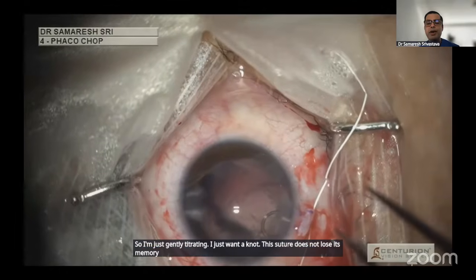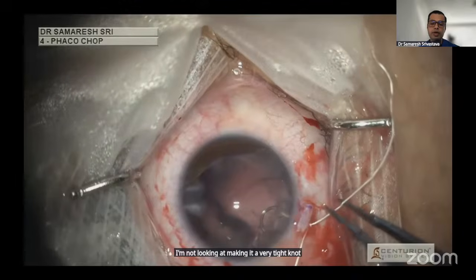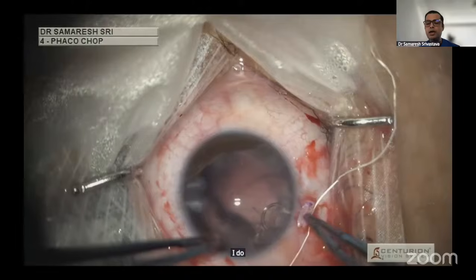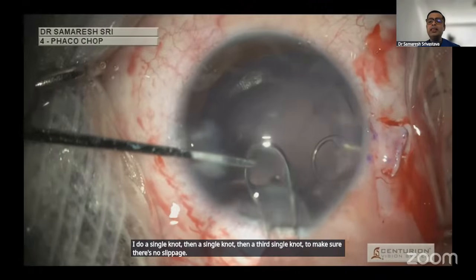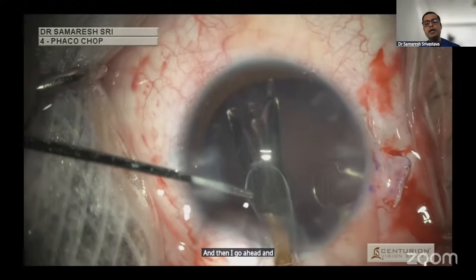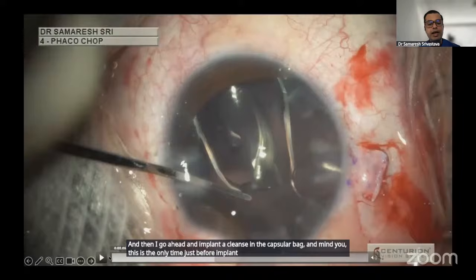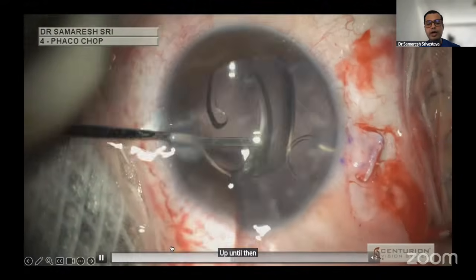So I just want the bag centralized. I'm not looking at making it a very tight knot over here. And this is me doing the second knot to make sure that I do a single knot, then a single knot, then a third single knot to make sure there's no slippage. And then I go ahead and implant a lens in the capsular bag. And mind you, this is the only time, just before implantation of this lens, that I made my main incision. Up until then, I had not even made my main incision.